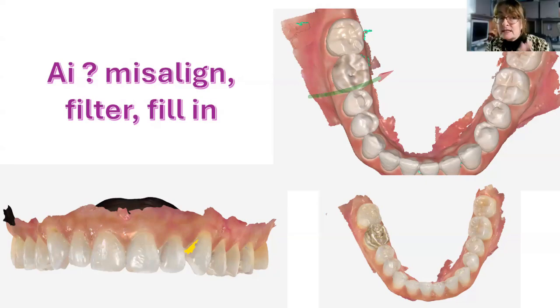Well, and I also like to state, in a case like this, right? If you were maybe making a mandibular night guard, let's say, from this scan, the yellow on the mesial of that cuspid would be okay for me to let AI fill it in because it is not impactful to the fabrication of the prosthesis we've scanned for.